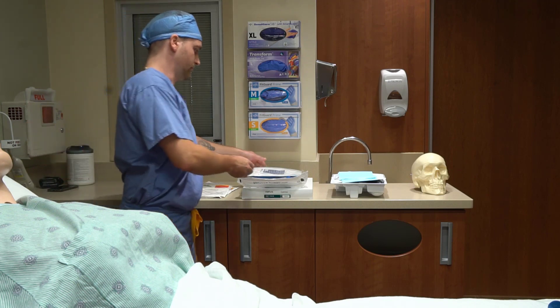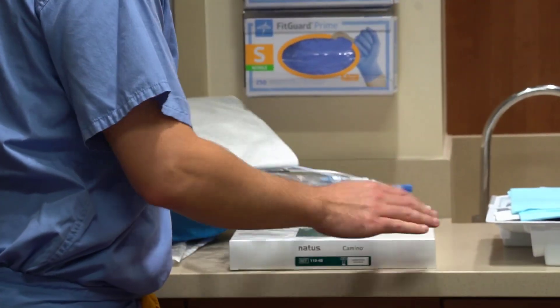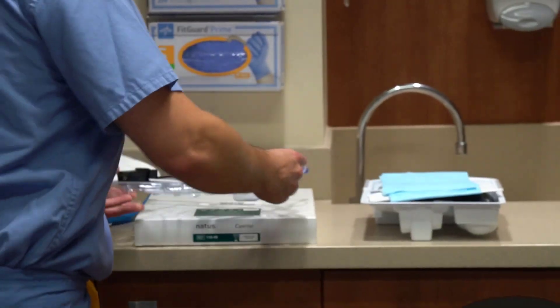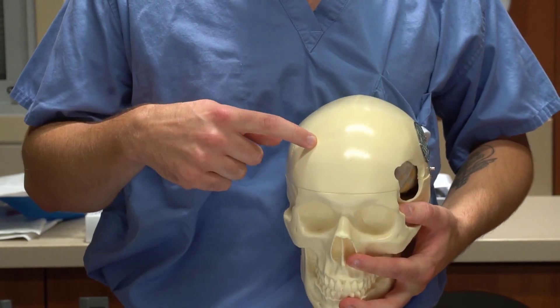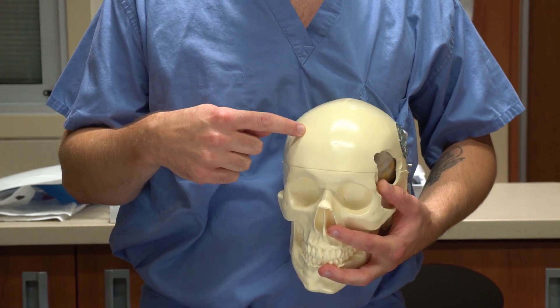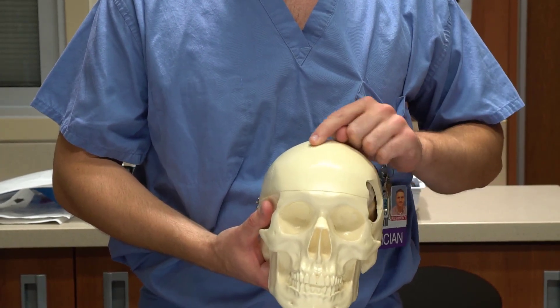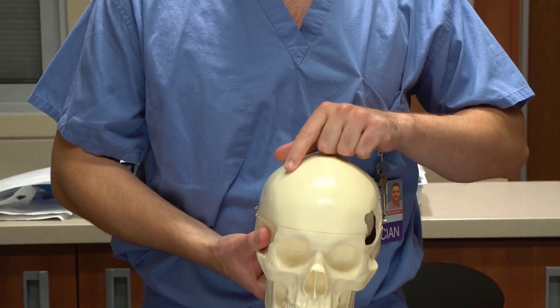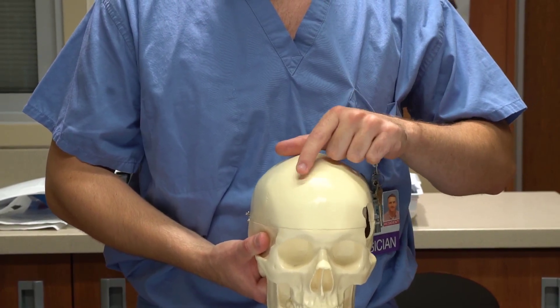The ventricular catheter is one we use frequently. It gets inserted into the brain, into the ventricular system. We typically insert it at Kocher's Point, which is about 11 centimeters back from the nasion and about 3 centimeters over — basically in midline with the eye, about a centimeter in front of the coronal suture. This allows us to drain fluid and also monitor ICPs at the same time.